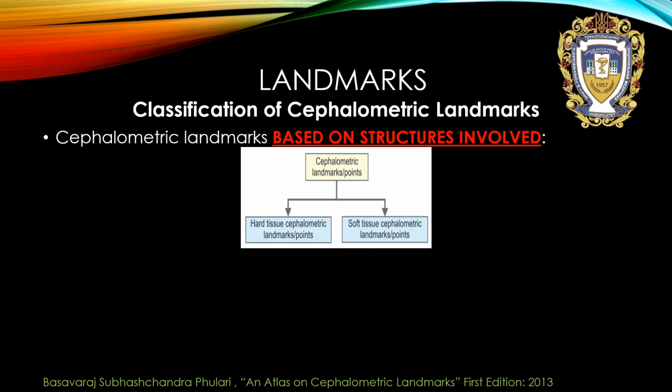Another classification: cephalometric landmarks based on structures involved. Based on hard tissue cephalometric landmarks and soft tissue cephalometric landmarks and points.